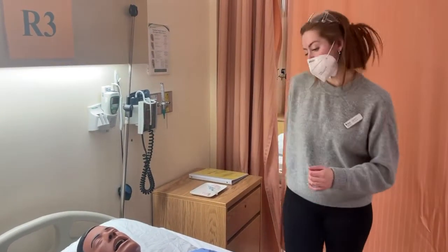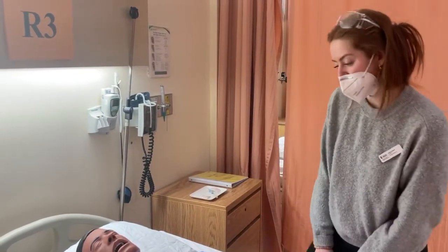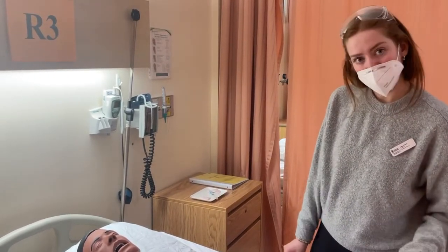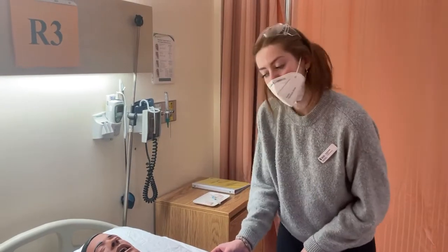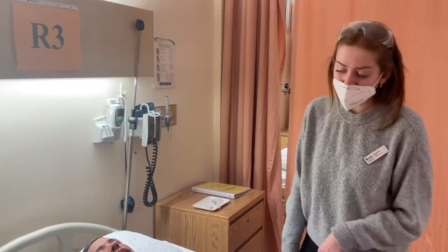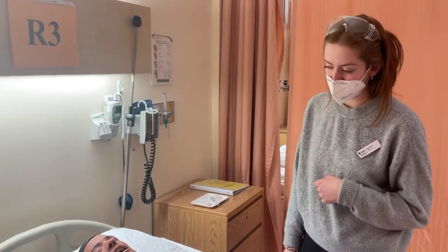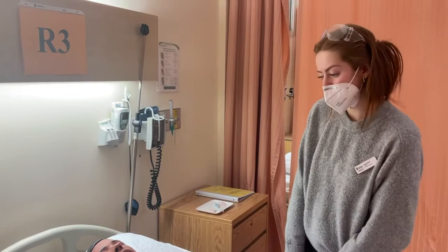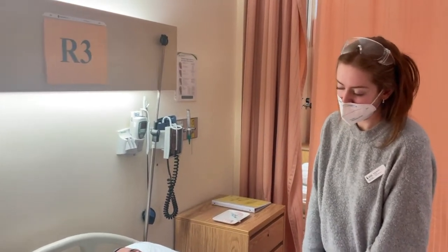So today, I'm going to be administering thiamine, and that is for your Wernicke's encephalopathy, okay? He says okay. So what it is, it's just going to be a pinch in your arm. If you have any shortness of breath, swelling, any itching, please pull your call bell and let us know. I will return in about 30 minutes after administering the medication to check up on you. And do you have any questions?